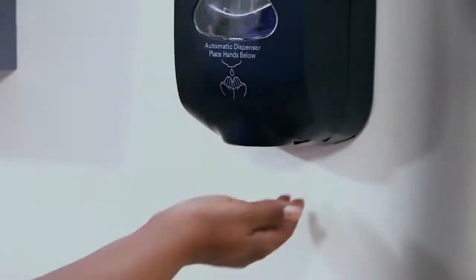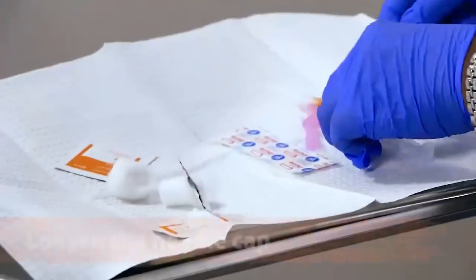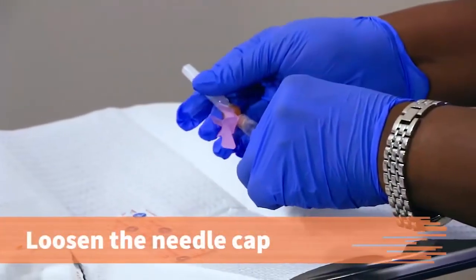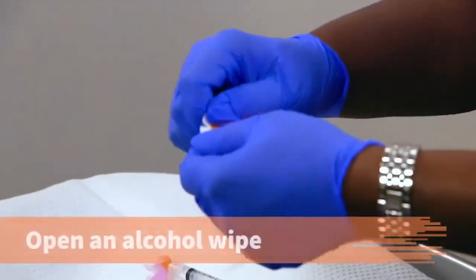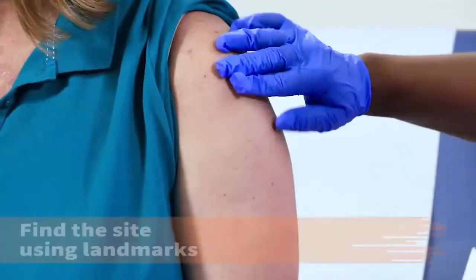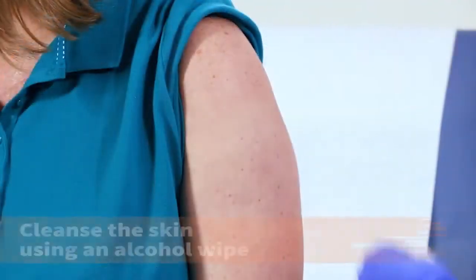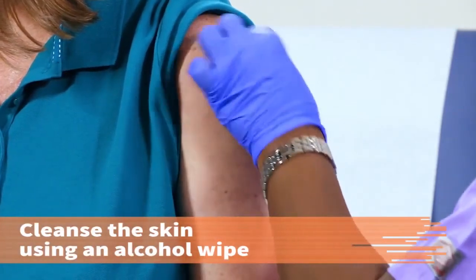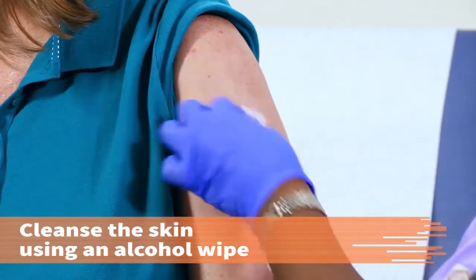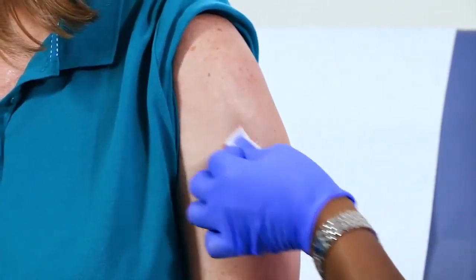Sanitize your hands again and put on gloves. Loosen the cap on the needle so that you'll be able to open it with one hand once you clean the injection site. Open the alcohol wipe. Find the site using the landmarks. Cleanse the patient's skin with the alcohol wipe using a circular motion and moving outward from the center. Use some friction to help clean the site. Create about a 2-inch circle at the site.